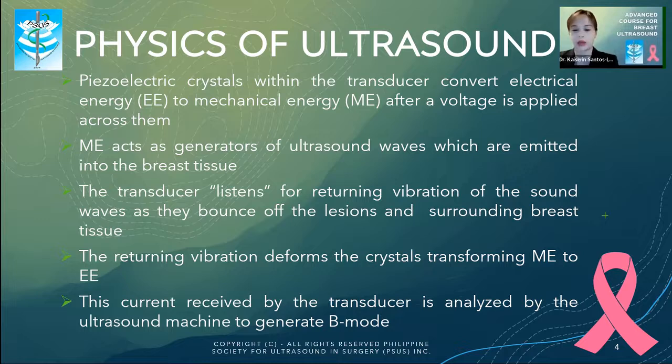Mechanical energy acts as the generator of the ultrasound waves in layers of the breast. The transducer then listens to the returning vibration of sound waves as they bounce off different lesions and the surrounding breast tissue. The returning vibration deforms these crystals, transforming the mechanical energy back to electrical energy.